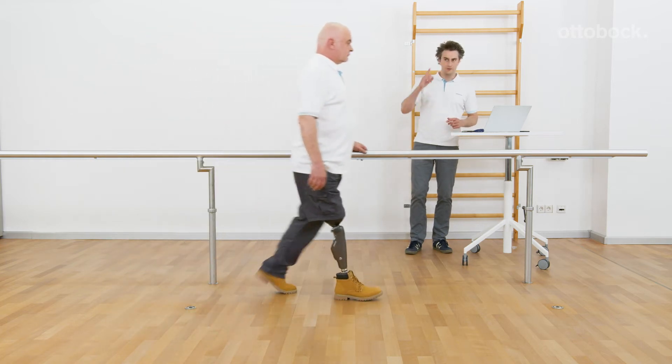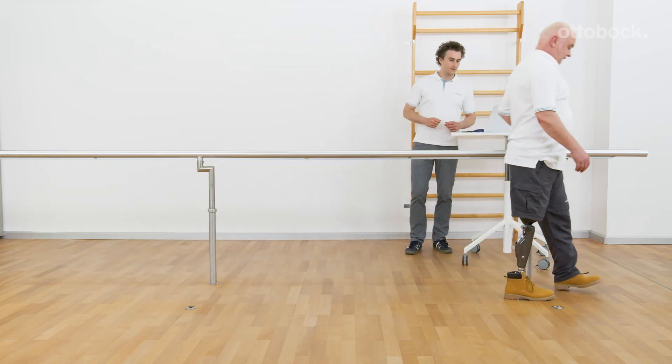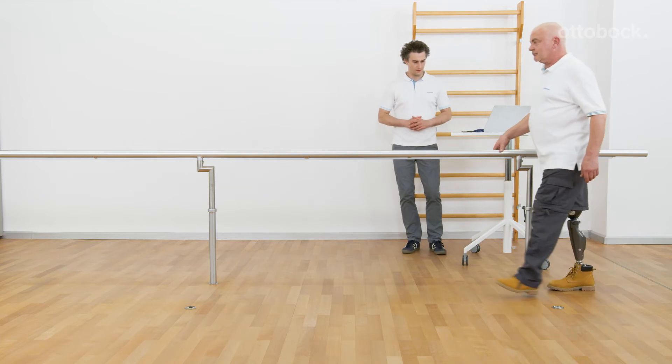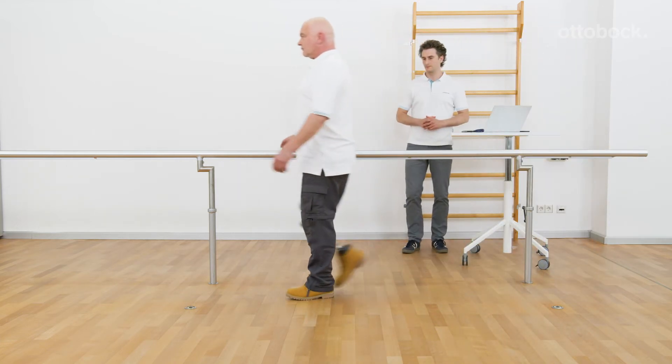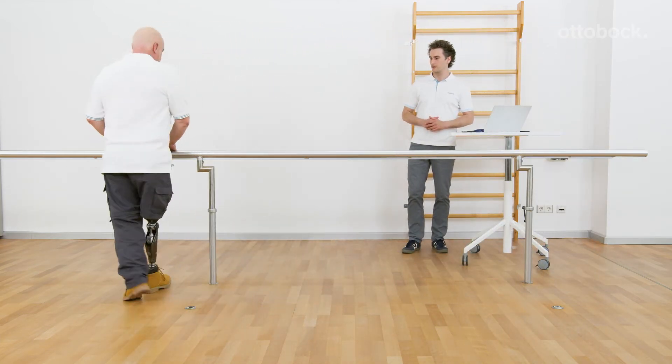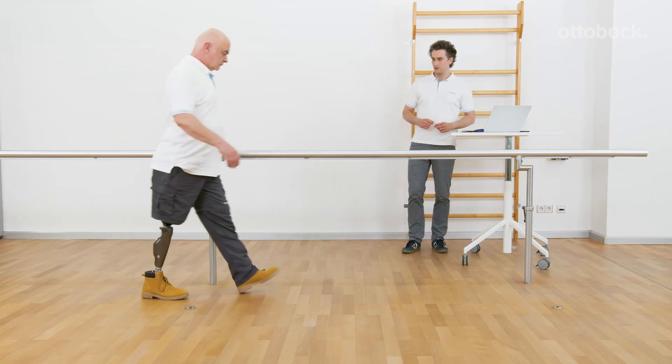For training purposes and troubleshooting, a feedback function can be activated in the new C-Leg. This function gives an acoustic signal whenever a stance release is carried out successfully.